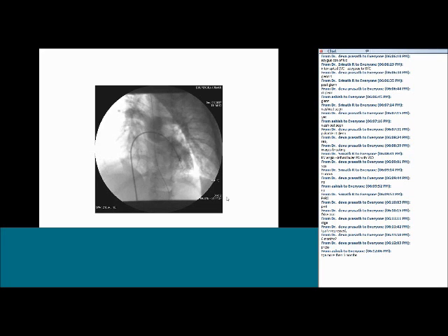actually in actual fact, the child was more than a month old, LV was looking regressed, and we did a balloon atrial septostomy. Mind you, doing a balloon atrial septostomy beyond a month is slightly unrewarding because the atrial septum becomes slightly more thickened, and sometimes of course we get good results by tearing the flap.